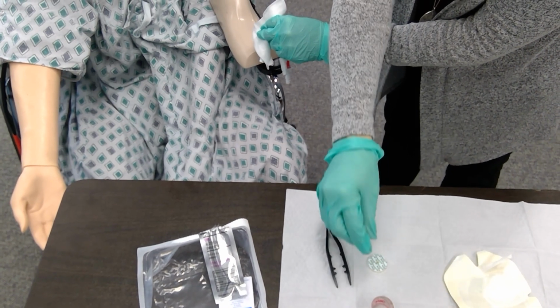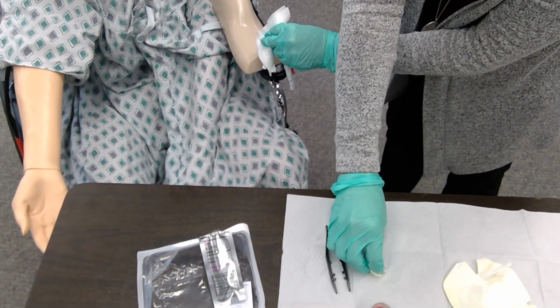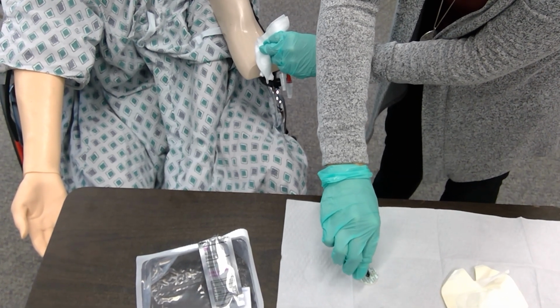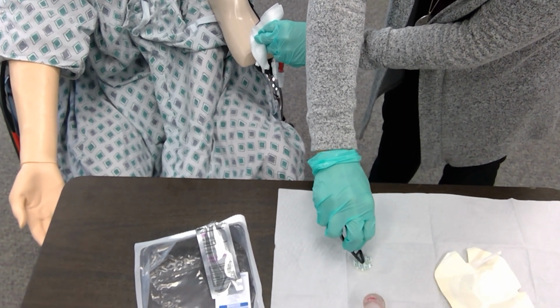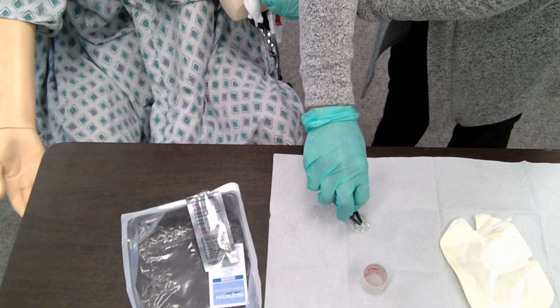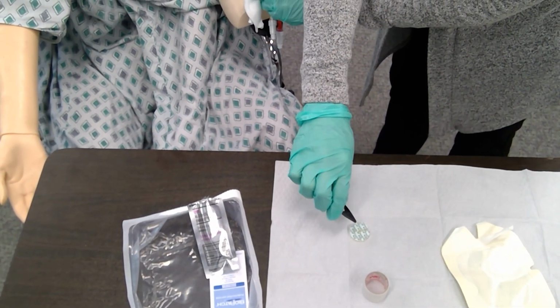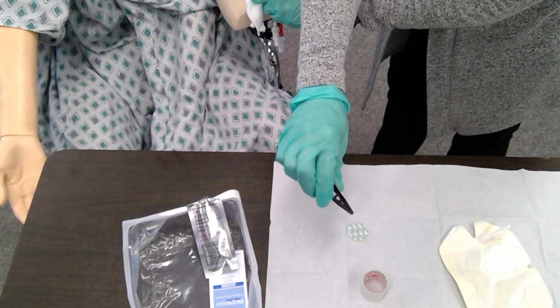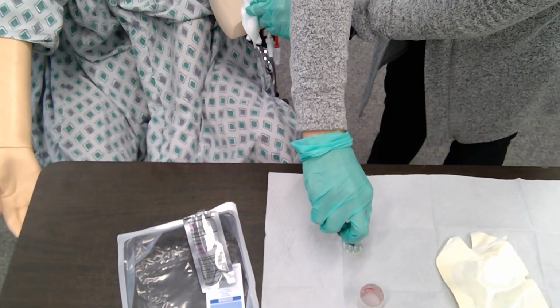If your hands are not contaminated, then you can pick the bio patch up and place that on the tube. You can pick it up like this to where it opens it for you and insert it that way. The main point with the bio patch is that the blue goes up. So think blue to the sky when you're putting a bio patch on.